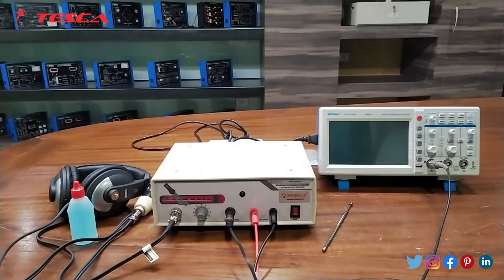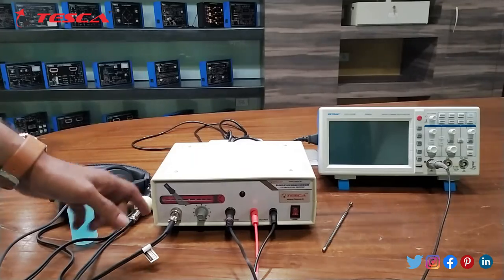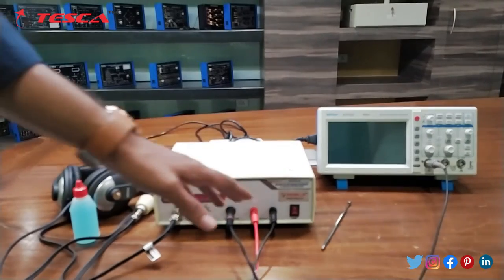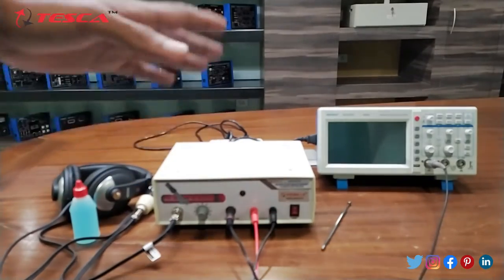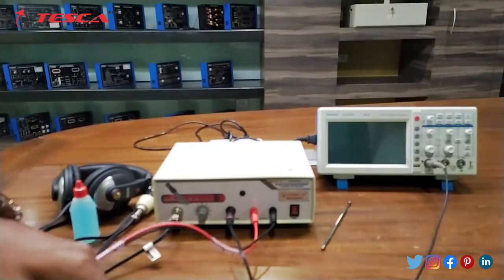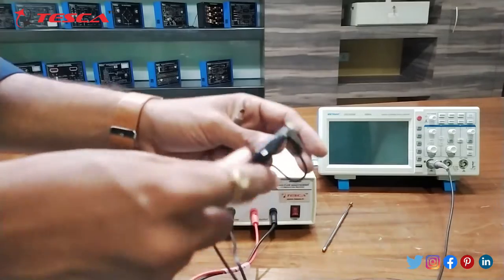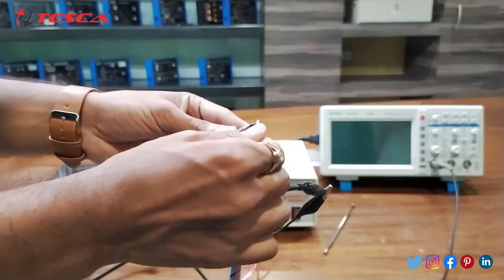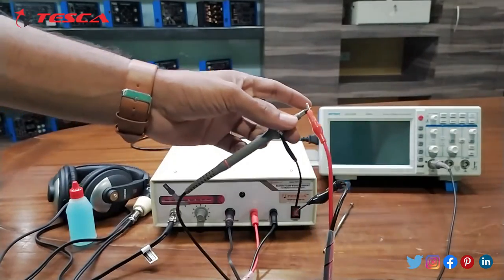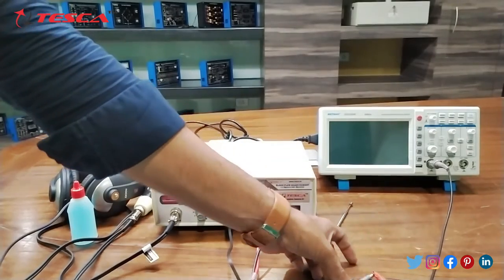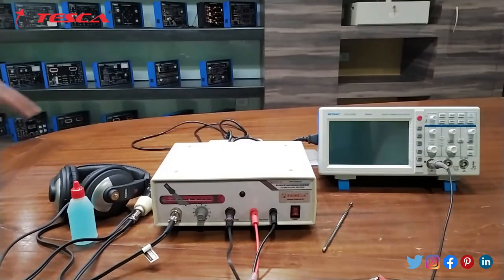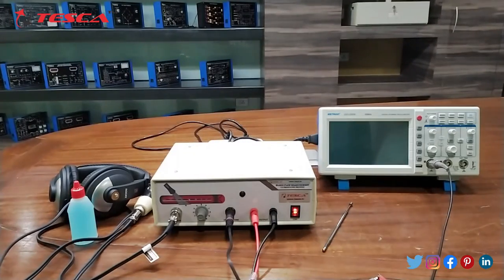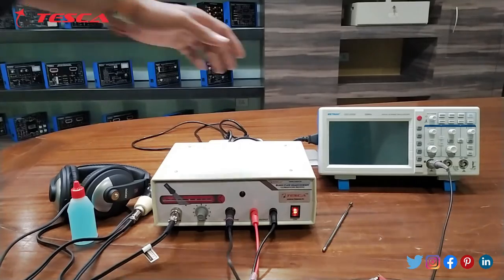Now let's talk about the working of this kit. First of all we will connect this transducer to the kit. Then we will connect this headphone to the kit. Then there are two patch cords which we will use to connect the DSO to this kit. The black color patch cord is connected to the black wire of the DSO and the red one is connected to the other wire of the DSO like this. Then we will switch on the apparatus from this button. Now our apparatus is ready to work. Now we will switch on the DSO also.